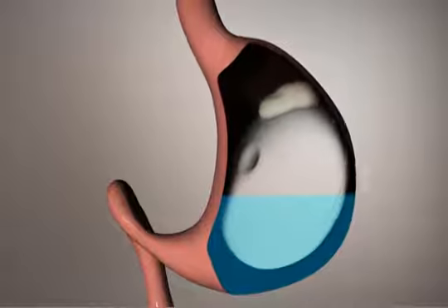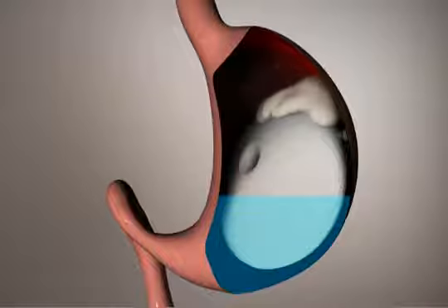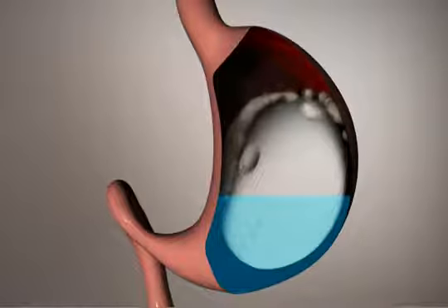The Ellipse fills the stomach and can assist you in feeling full and eating less. This leads to weight loss over the multiple months the Ellipse is present in the stomach.